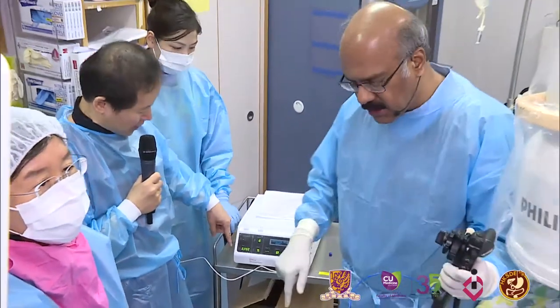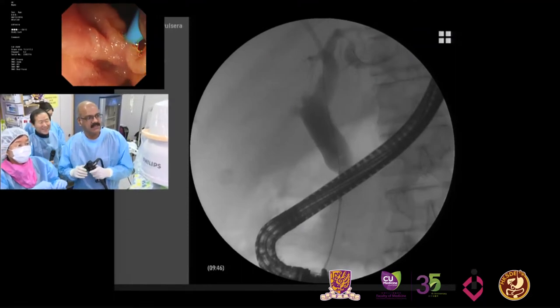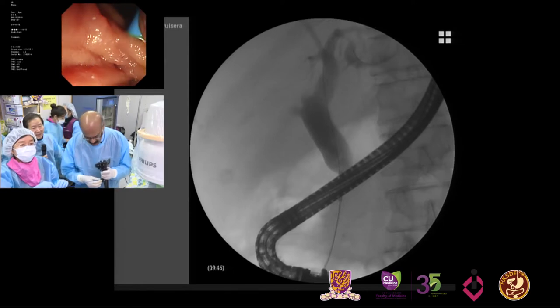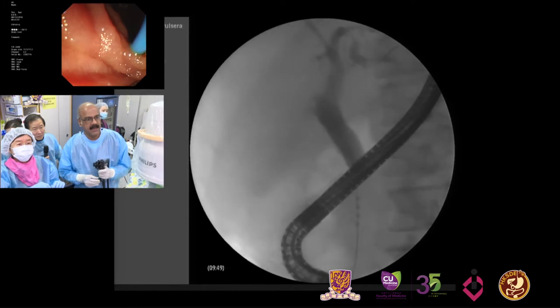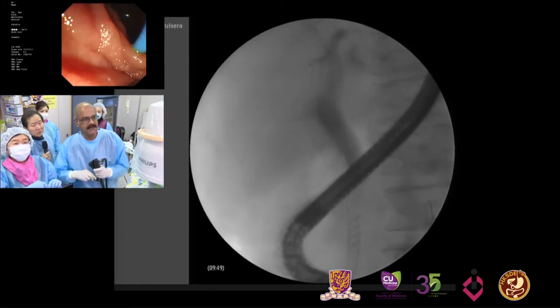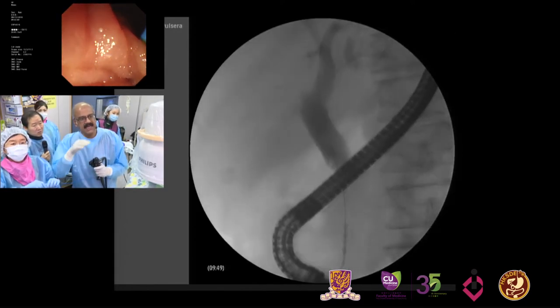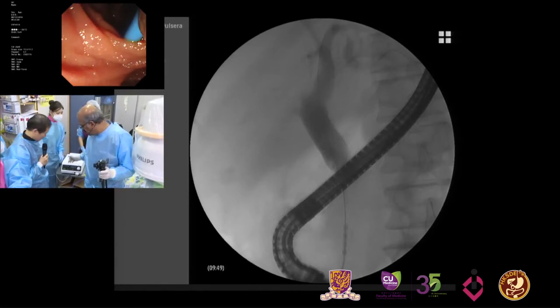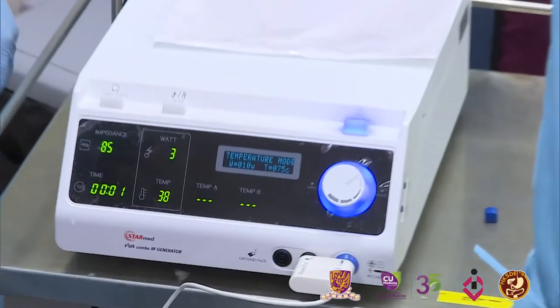The 2 minutes are over. We did a lot of gossip during the 2 minutes, so we did all this talking. Now that's over. What we'll do is get down and do another, a lengthier stricture. This is the second part. After this is over, we put in a self-expanding partially covered metal stent. I come exactly to the point where this half is covered, and then we'll start the process. Again, I switch it on here, and then it starts off.